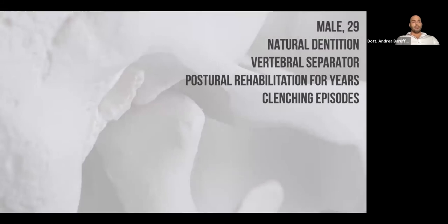This is a male patient, a victim of the pandemic, 29 years old, with natural dentition. He had a history of a vertebral separator.